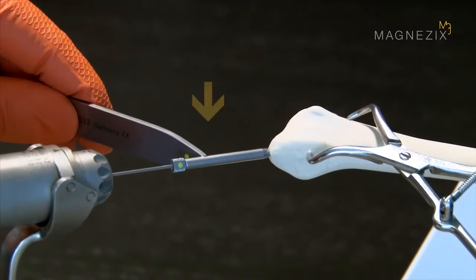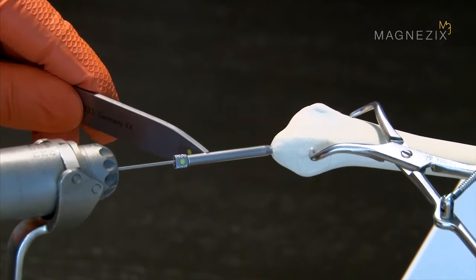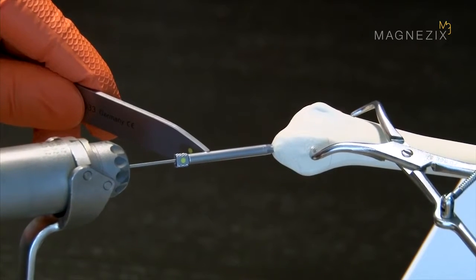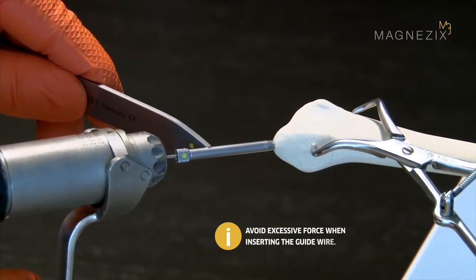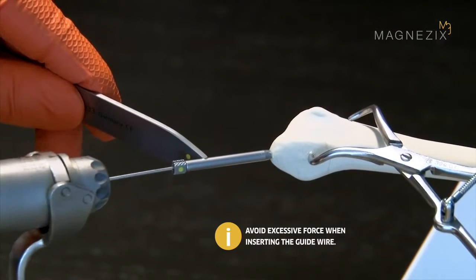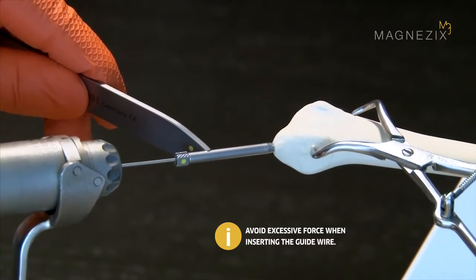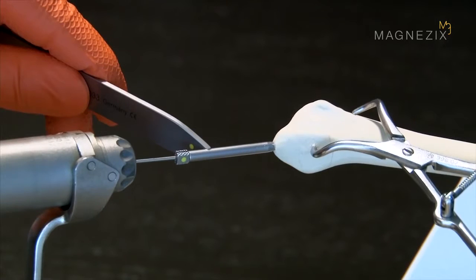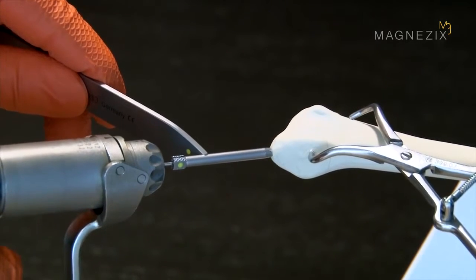Position the guide wire through the double drill guide with the fitted drill guide until it is in the required position. If necessary, monitor using an image intensifier. Avoid using excess force when inserting the guide wire. This will bend the guide wire and make it difficult or impossible to ream or insert the screw later on.